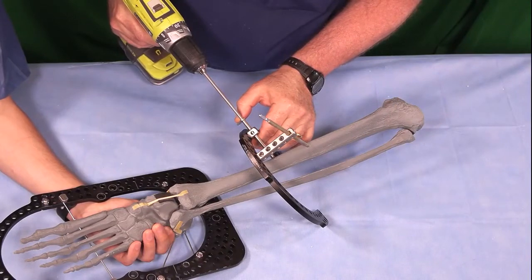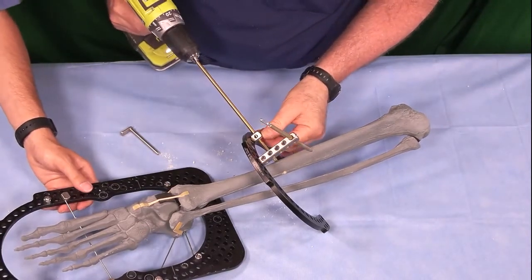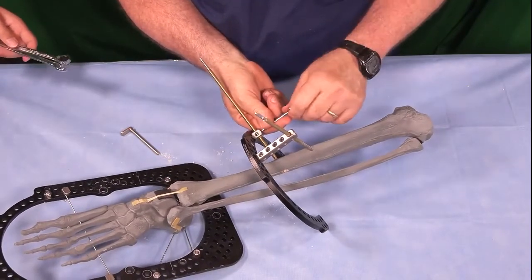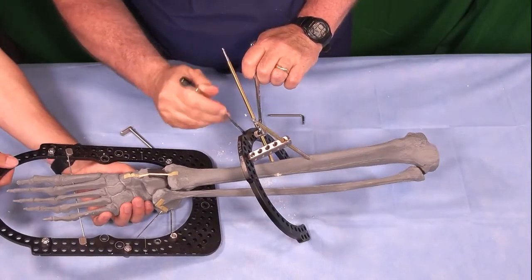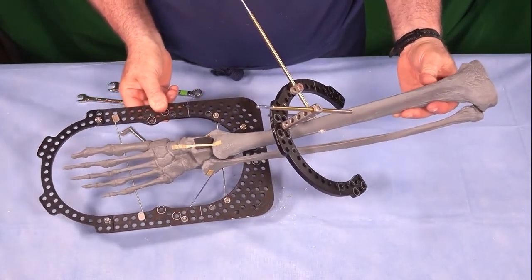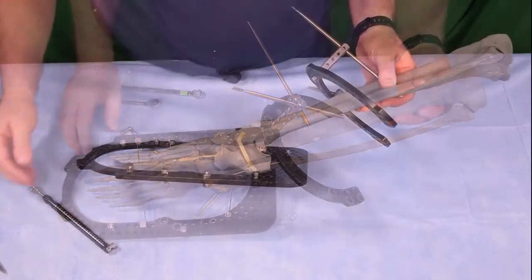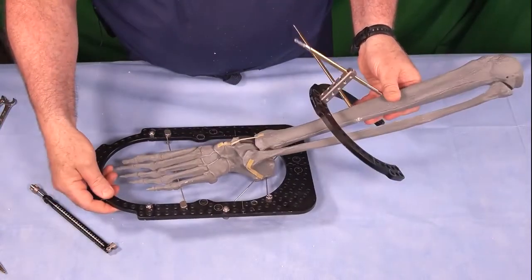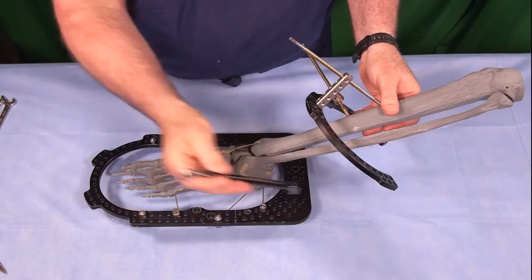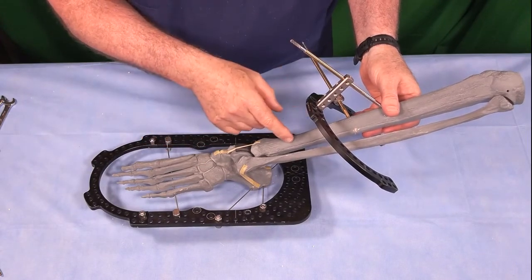Now we'll add an additional point of fixation on the tibia. So now we have stable fixation on both ends. At this point we can add our struts, and based on where our struts come out, we can decide where we're going to place additional fixation. We now have stable fixation in the tibia, stable fixation in the foot. So now we can add our struts in the hexapod configuration. And based on where our struts come out, we can decide where we want to add additional fixation to the foot and something also below the ring here.